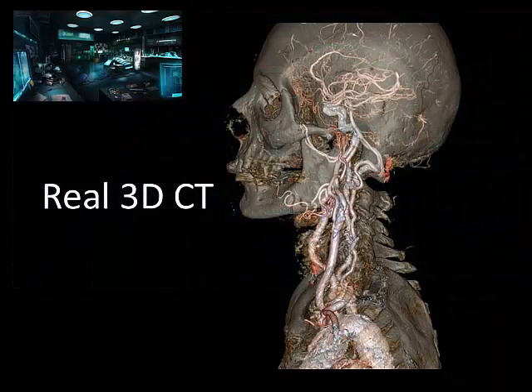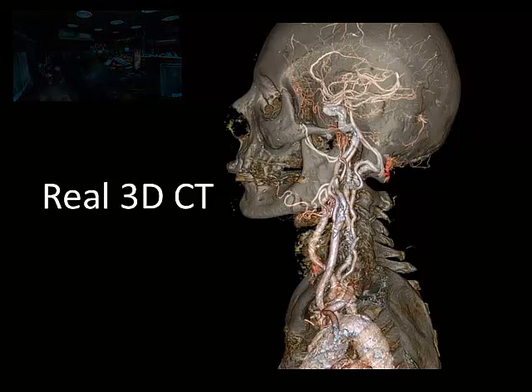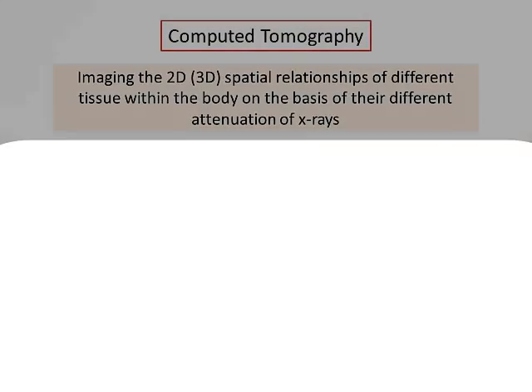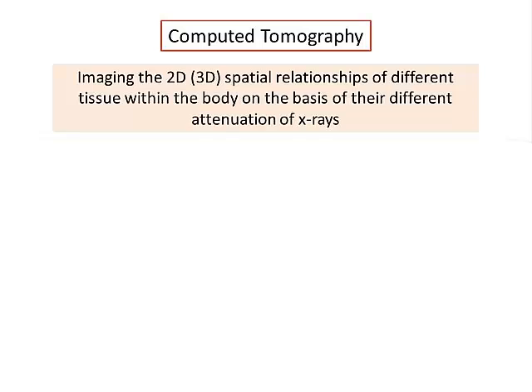The irony is that although the sickbay is a load of sci-fi phooey, the scan itself is a genuine computed tomography reconstruction, so demonstrating that the state of the art of scanning is better than science fiction. This talk is about how computed tomography works.